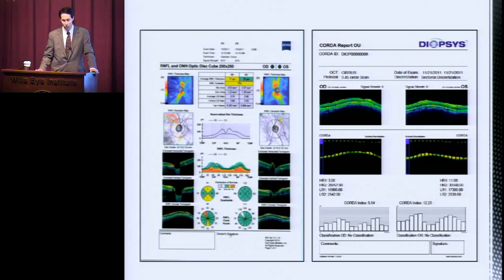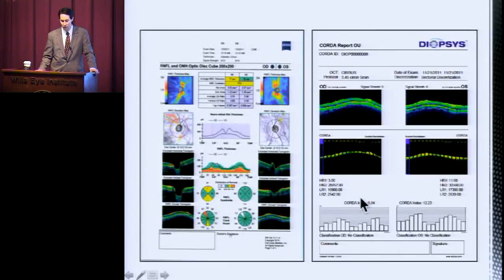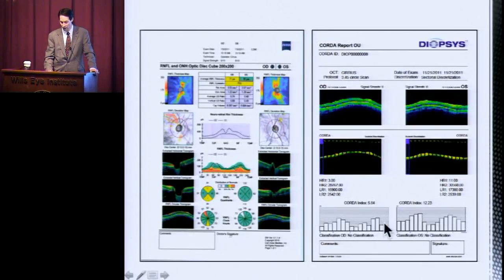This shows you the typical spectral domain OCT, and then the CORDA sub-analysis, showing you the different parameters — HR1 and 2, LR1 and 2 — and also breaking it down further without classification in this printout.